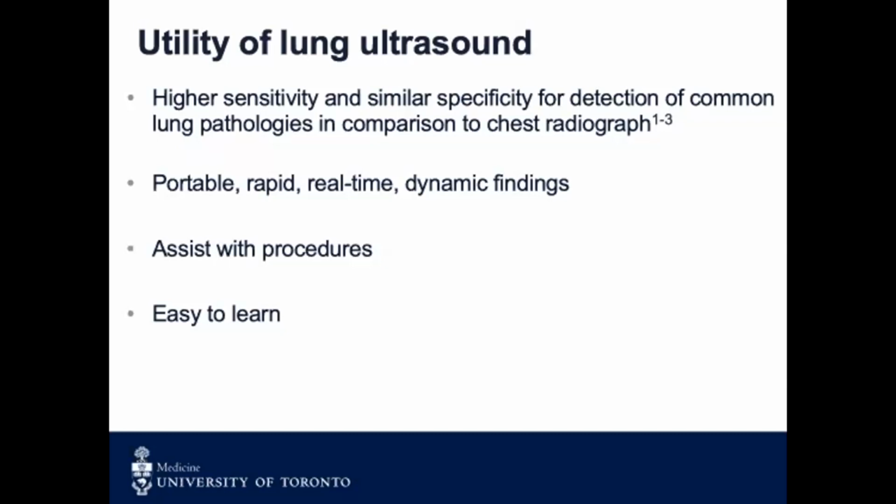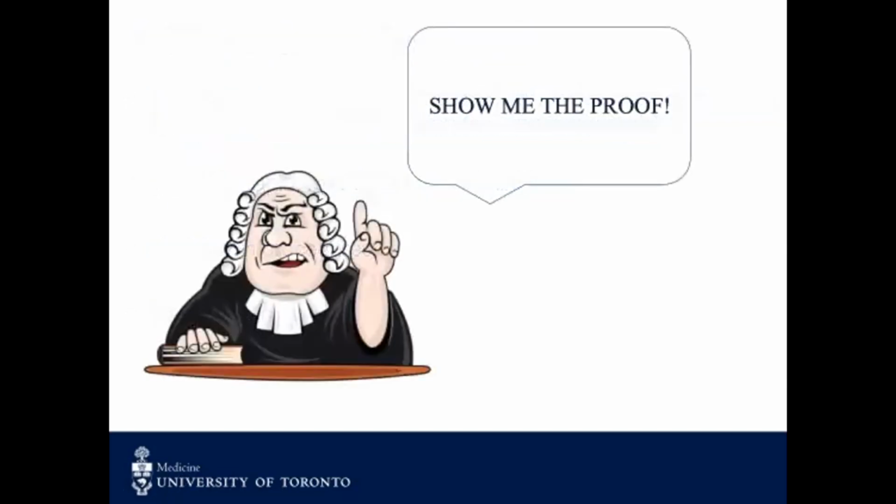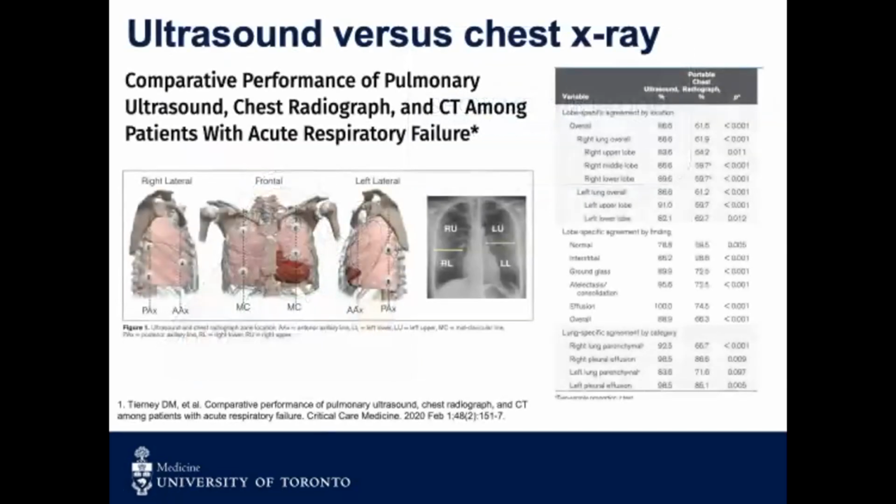And as we know, it's portable, it's rapid, it's dynamic, meaning that things that we do to patients, either changing their volume status or ventilation, can all have changes that we can immediately see. The use of lung ultrasound with procedures is long known, and so that's not new, and I'm going to try and convince you today that it's quite easy to learn. So let me show you the proof. So starting out by discussing 3 different articles.